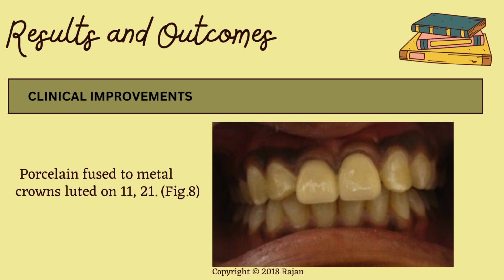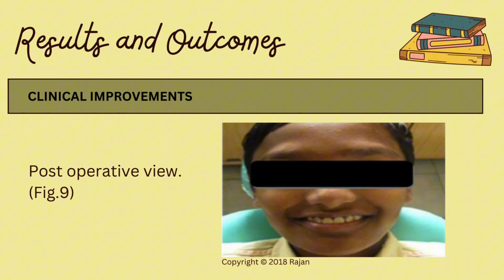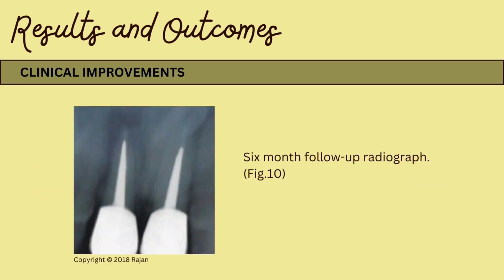teeth 11 and 21, restoring their form and function. Post-operative view. Figure 9 showcases the final post-operative appearance, highlighting the natural aesthetics achieved. 6-month radiograph. Figure 10 demonstrates the stable position and healthy bone surrounding the restored teeth at the 6-month follow-up.